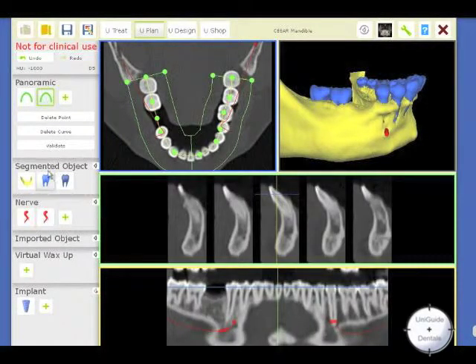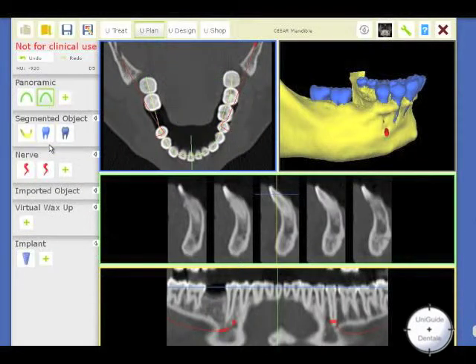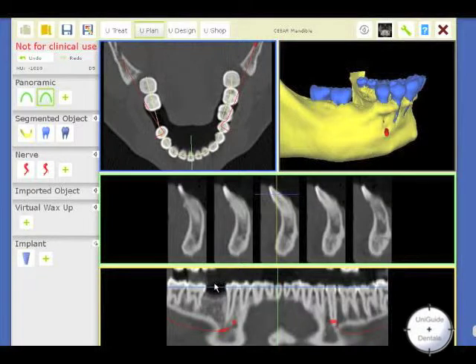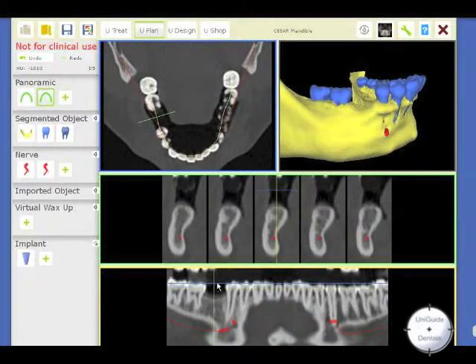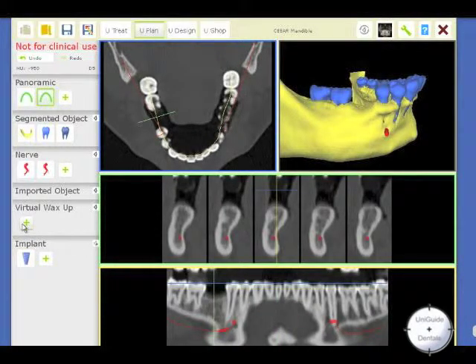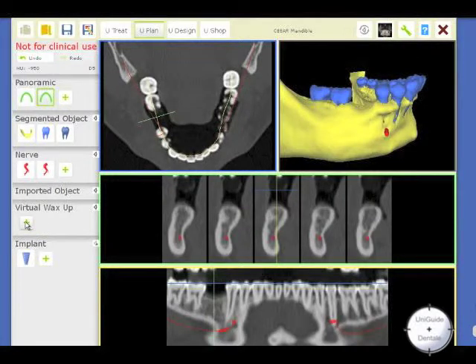When this is done, you validate the second panoramic curve. You make a click on top of the place where you want to replace the tooth. And then you go to Virtual Wax-up.